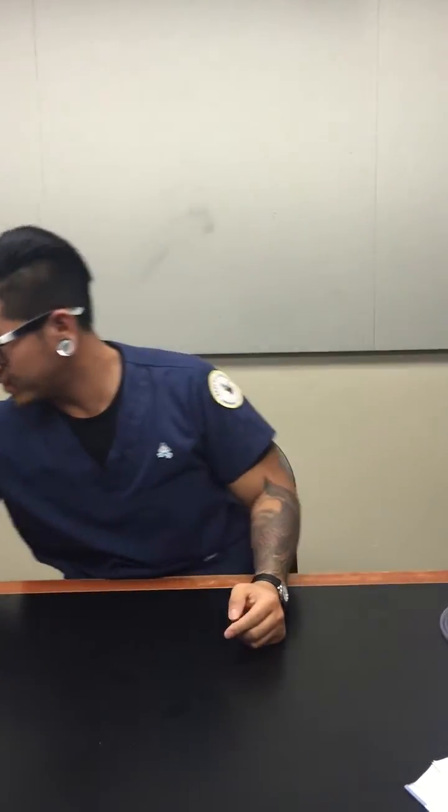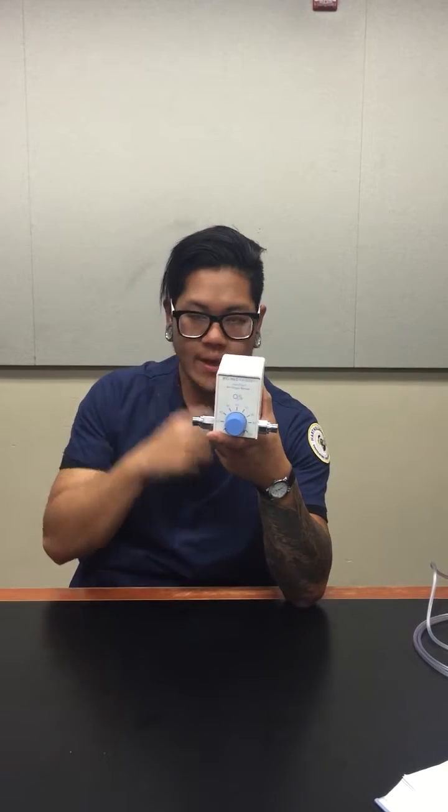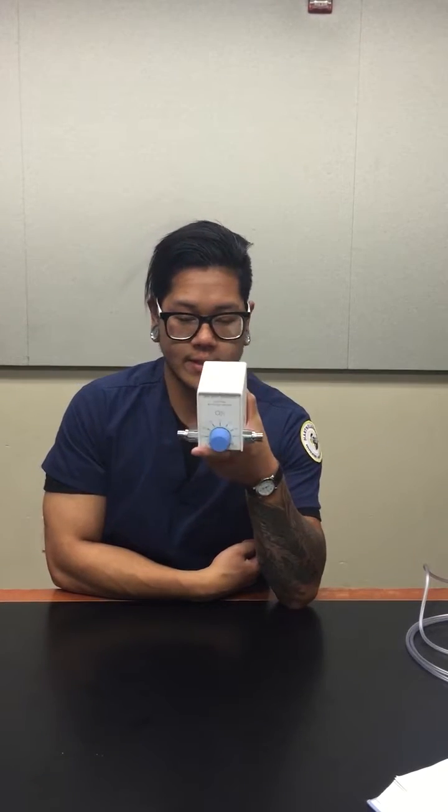Okay, my last one is O2 blender. This is my oxygen blender. Okay, so this is also a high flow system, and it provides an output flow of at least 60 liters per minute. The FiO2 range for this is 21% to 100%, and its FiO2 stability is that it is fixed.